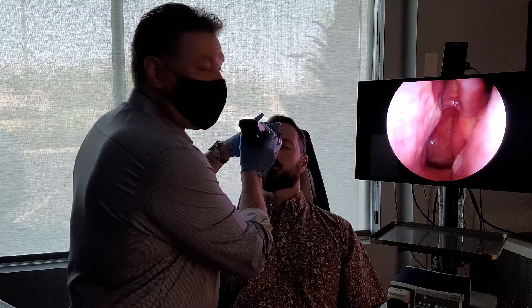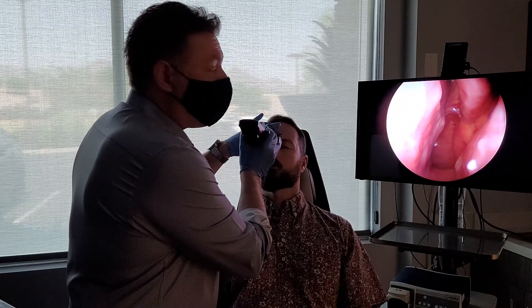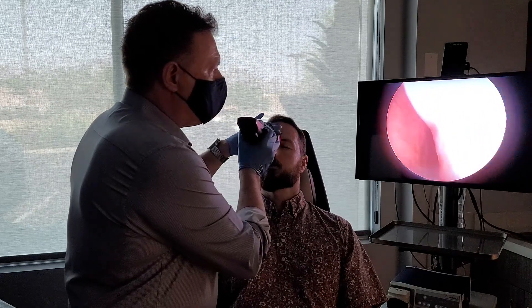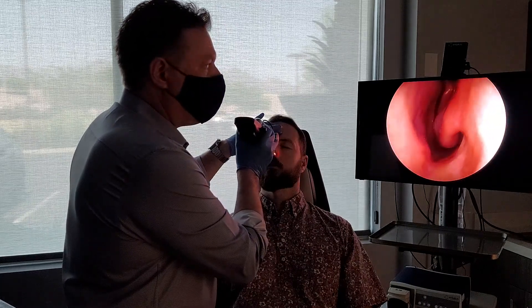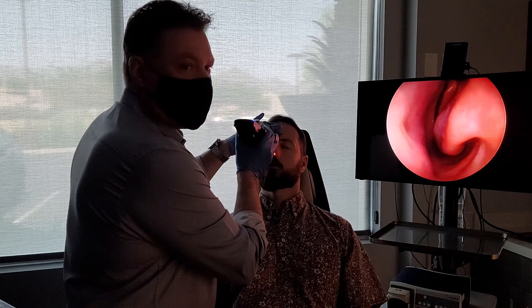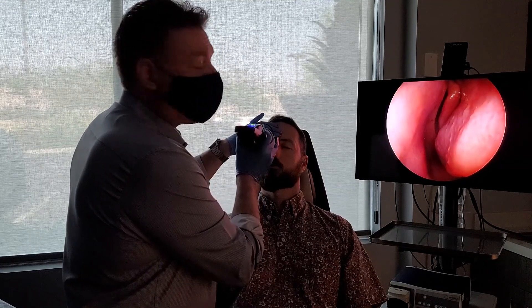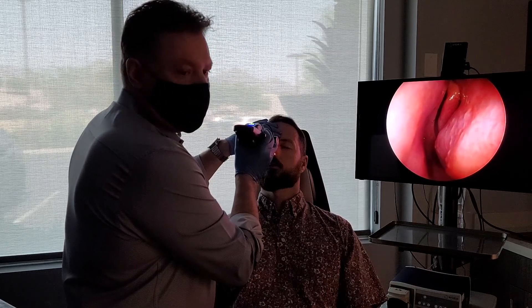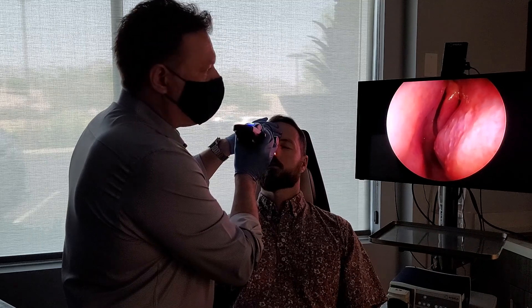That's the extent of the nasal examination. But this is the beauty of what we can generate and what we can see inside the nasal cavity with a scope versus just looking in the front with the nasal speculum. When we see patients in the office, oftentimes we're gonna ask if we could do a scope — even though it has an extra cost and it is a procedure — it does give us that much more information to treat Kevin's nasal cavity conditions appropriately.